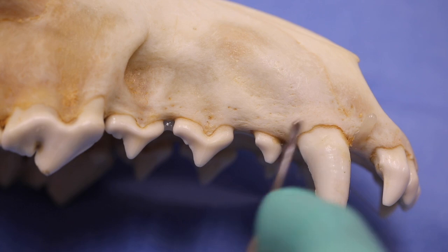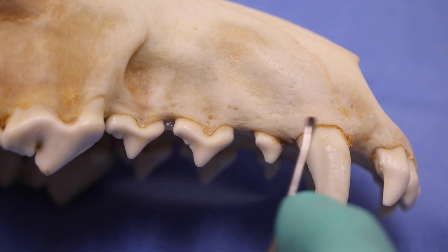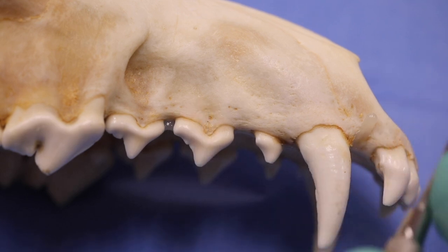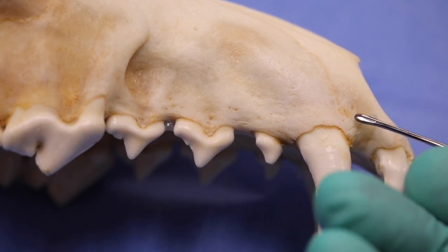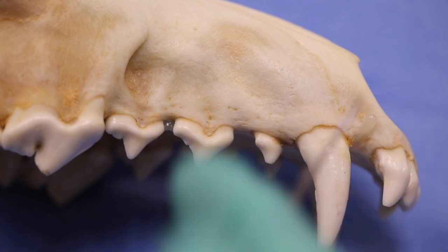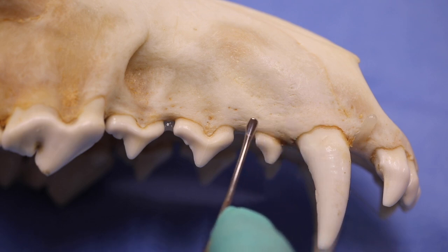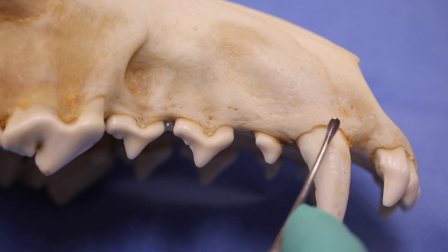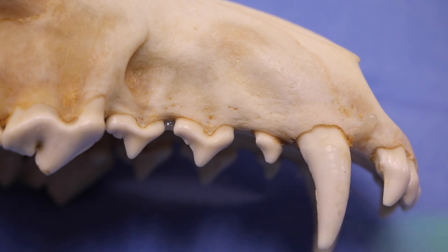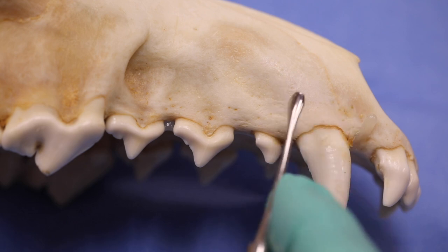What we want to do is go around the periphery of that whole zone of attached gingiva. It's really thick here and starts to trail off a little bit as we get to the third premolar where it gets thinner. The key thing to keep in mind is that we want to work throughout that whole margin of attached gingiva, initially getting about a millimeter to a millimeter and a half started, so we don't use the elevator in one spot and then put pressure distal and mesial — especially with the big end — because that pressure point is where the flap is going to rip.